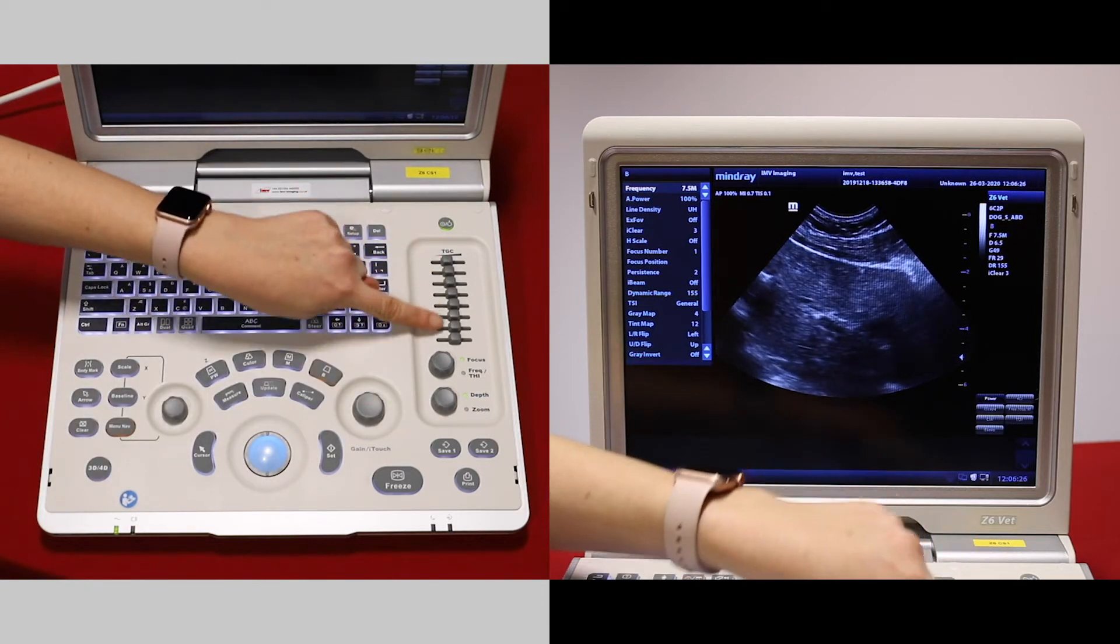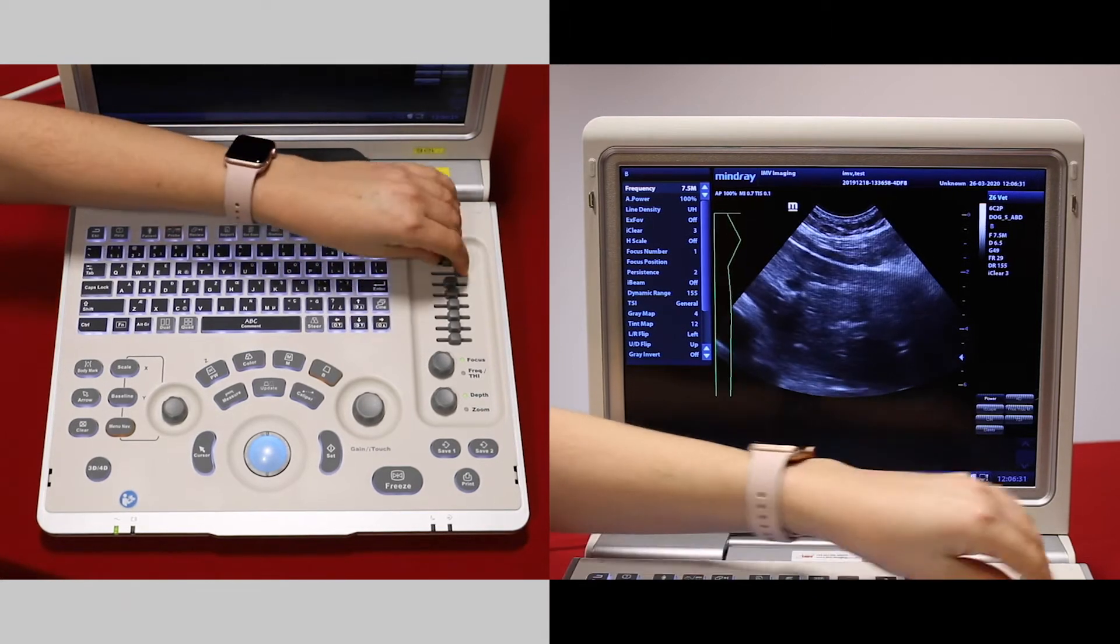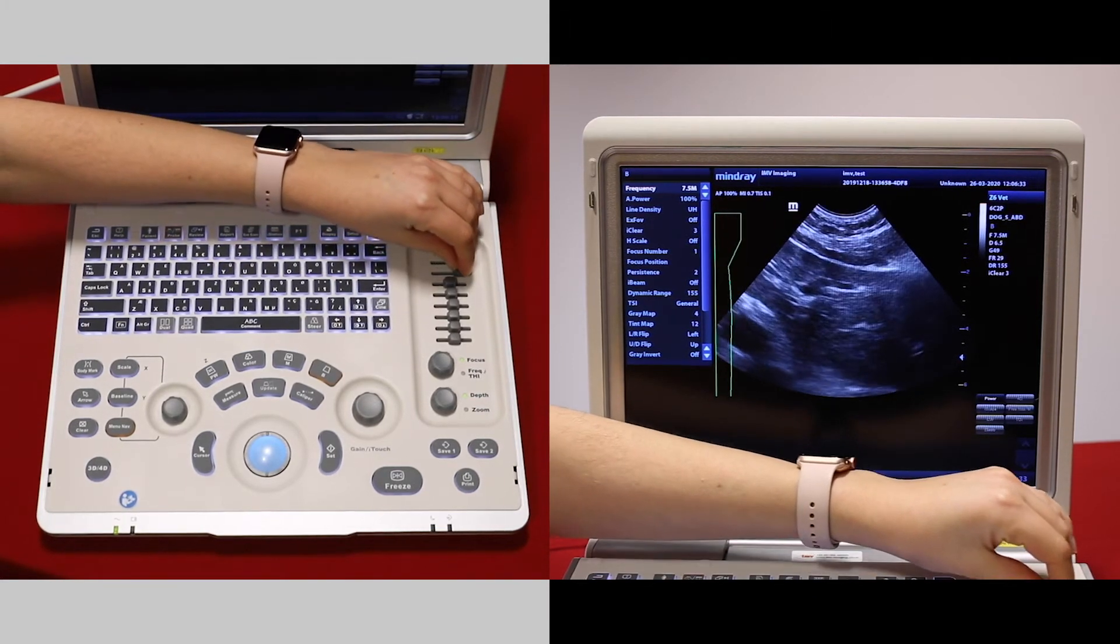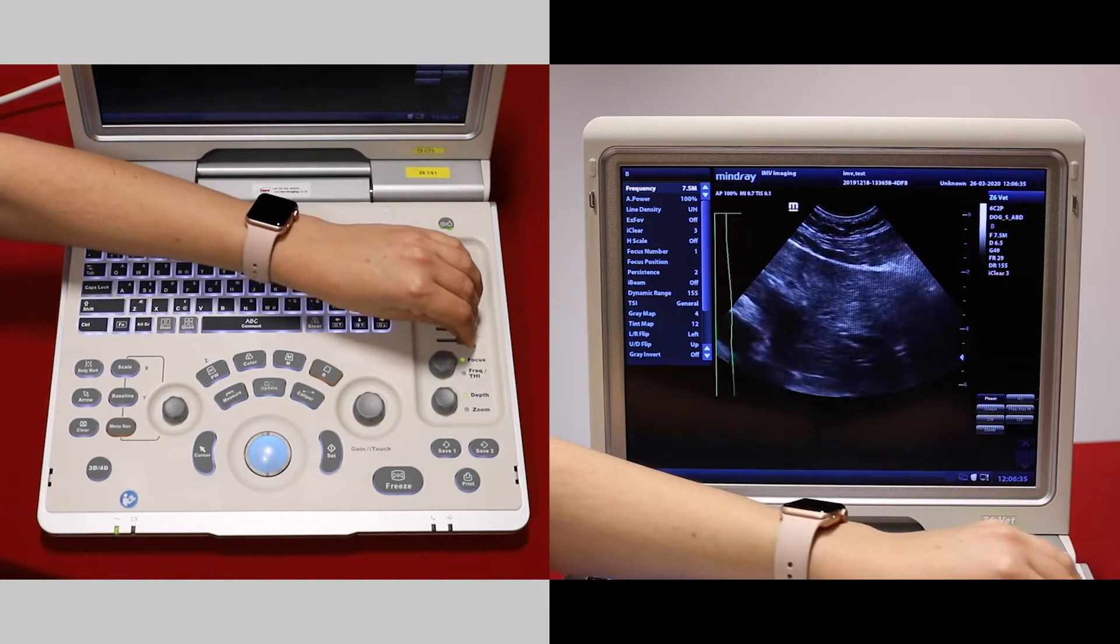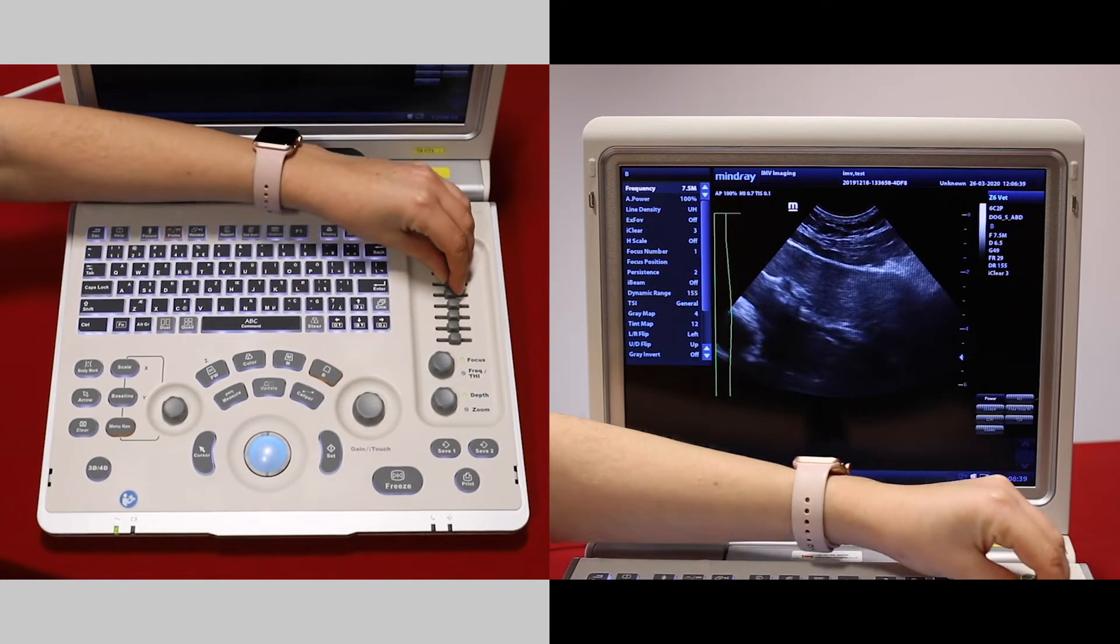The time gain compensation sliders change the gain per line of the image. At the top here we can increase or reduce our gain, and the bottom ones change the gain at the bottom of the screen. Make sure you've got an evenly gained image.